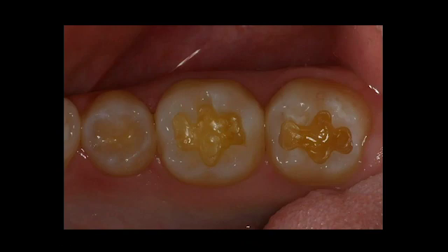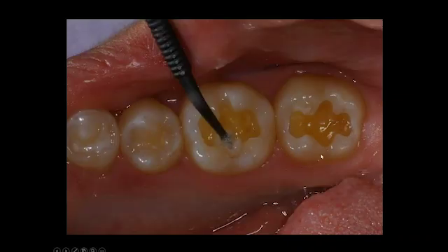So we removed the amalgam, we've removed any decay that was leaking under there, we extend the margin slightly, and now we're ready to place the composite. We'll go ahead and etch the tooth. I still like using a fifth generation bonding agent where we're etching and bonding; however, sixth and seventh generation bonding agents work very well. The Wago Fill composite material can be used with any type of bonding agent, which is nice.